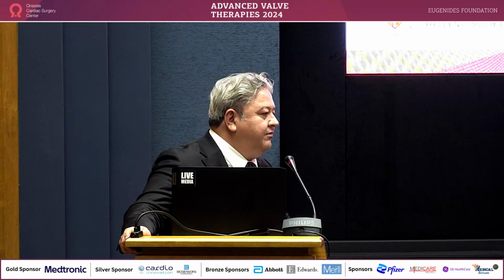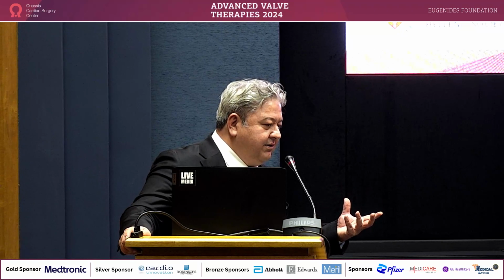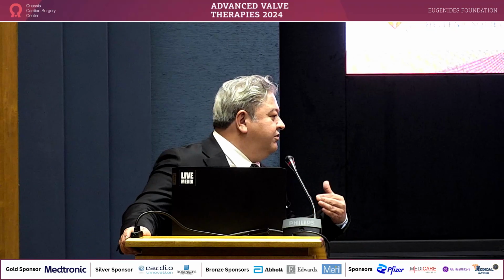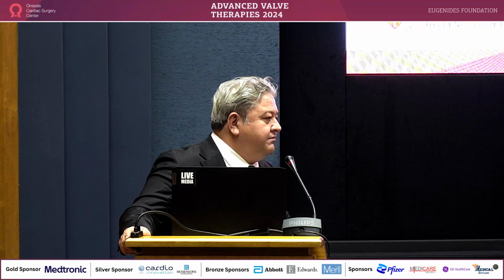So you leave the Terumo in position. Yes. So you have the access. That's very important, because if you lose the access, you have to start again. I have never seen it, but some operators change the guide wire sometimes, like in VSD closure, but the Terumo is always working. Fine.